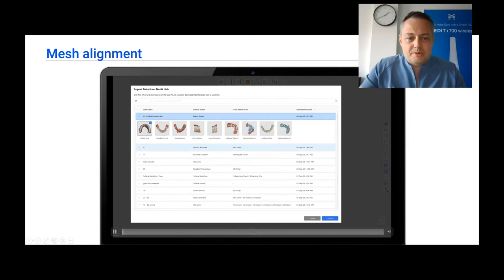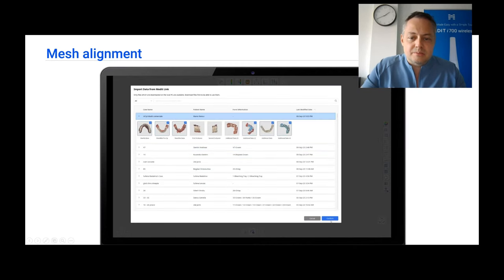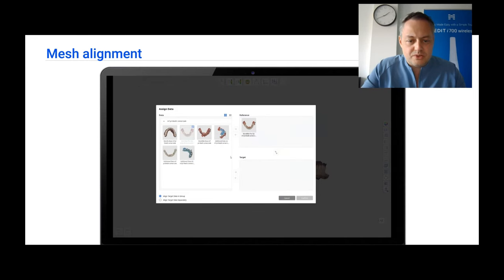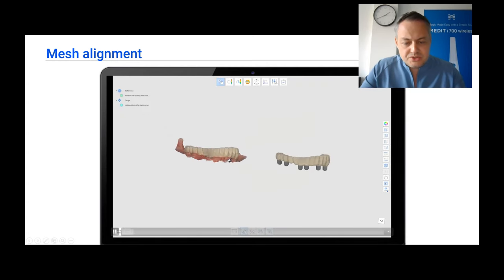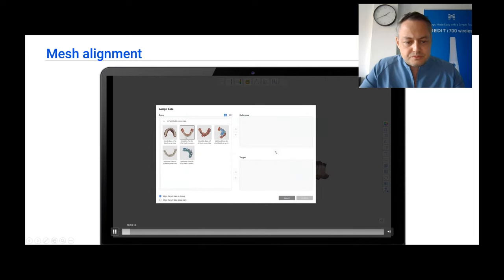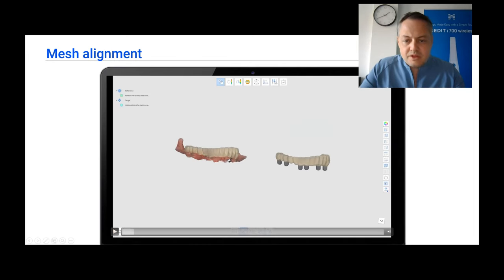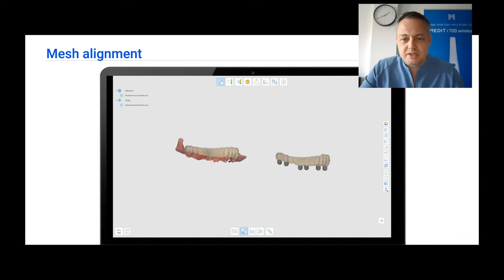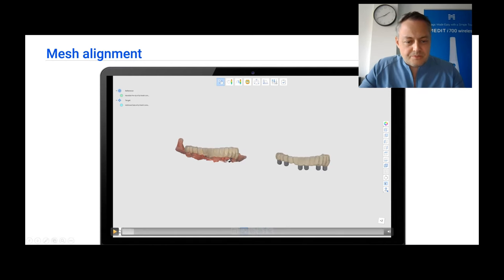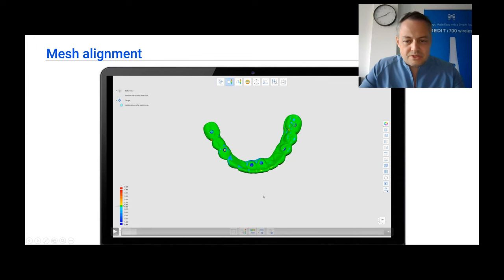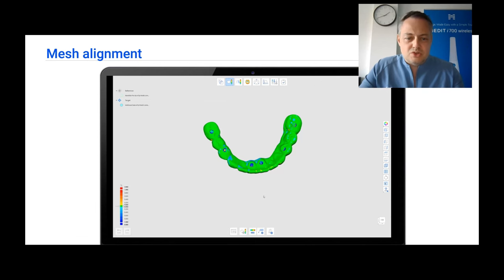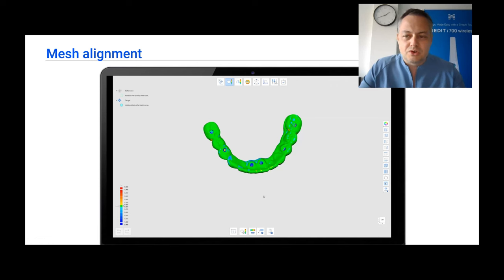We are going to open Medit Design, select the meshes that we need, everything together. Now we can start aligning the objects. We are going to align the prosthesis with the digital scan analogs, and this is going to be very straightforward — handled automatically — for the simple reason that there is a huge amount of common data between the pre-op and this prosthesis. So the pre-op is going to be the fixed position, and this prosthesis that is an additional scan is going to be brought to the correct position.